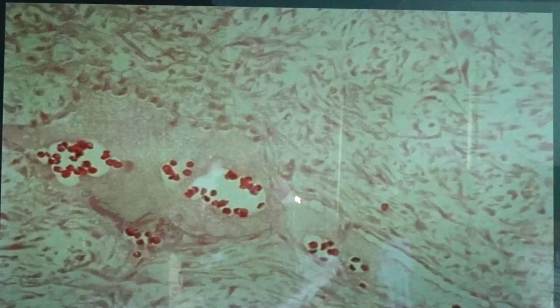Okay, let's try to see. This would be the tunica intima. Okay, tunica intima. We have the tunica media, and then you have the adventitia. Okay, the tunica intima is thickened. So there's intima thickening, leading to the presence of a slit-like lumen. Okay, slit-like lumen.